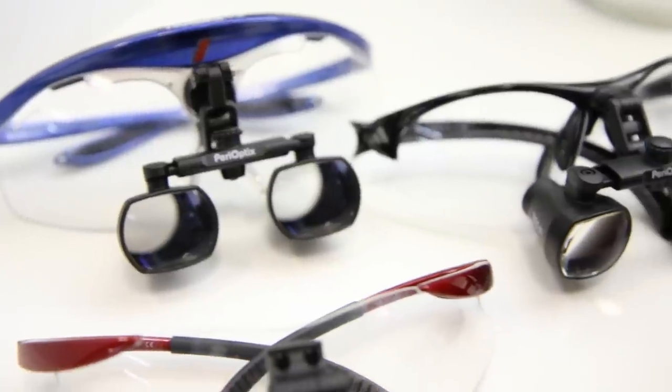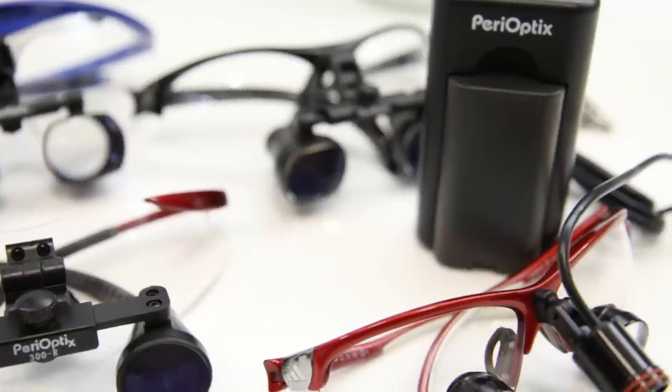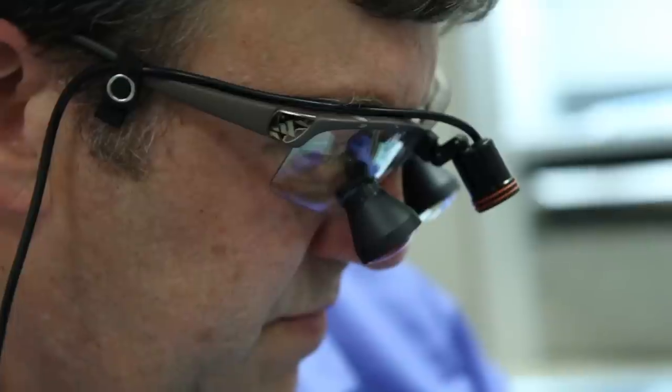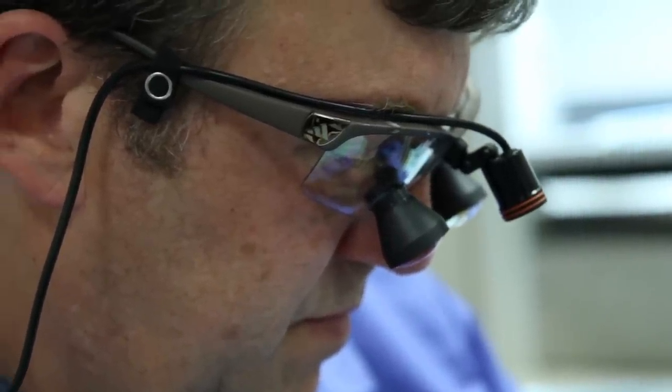It is imperative that you use magnification, such as the Perioptics line of magnification, to be able to work more effectively and precisely. With Perioptics, your own prescription can also be placed in the eyeglass lenses if needed.